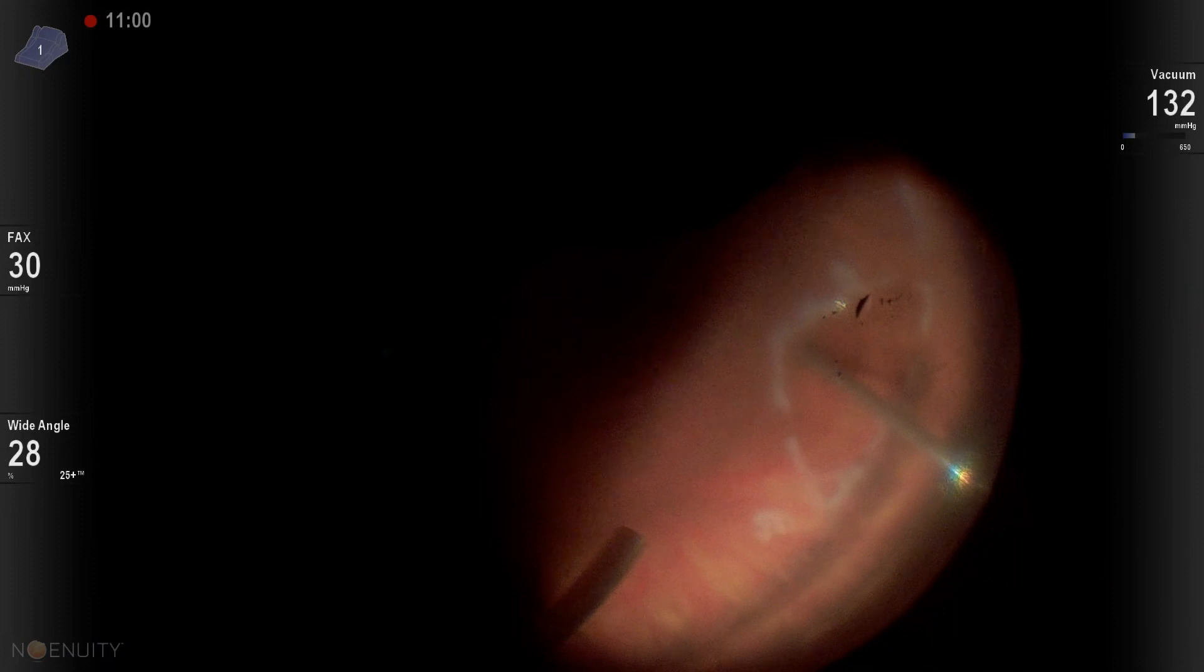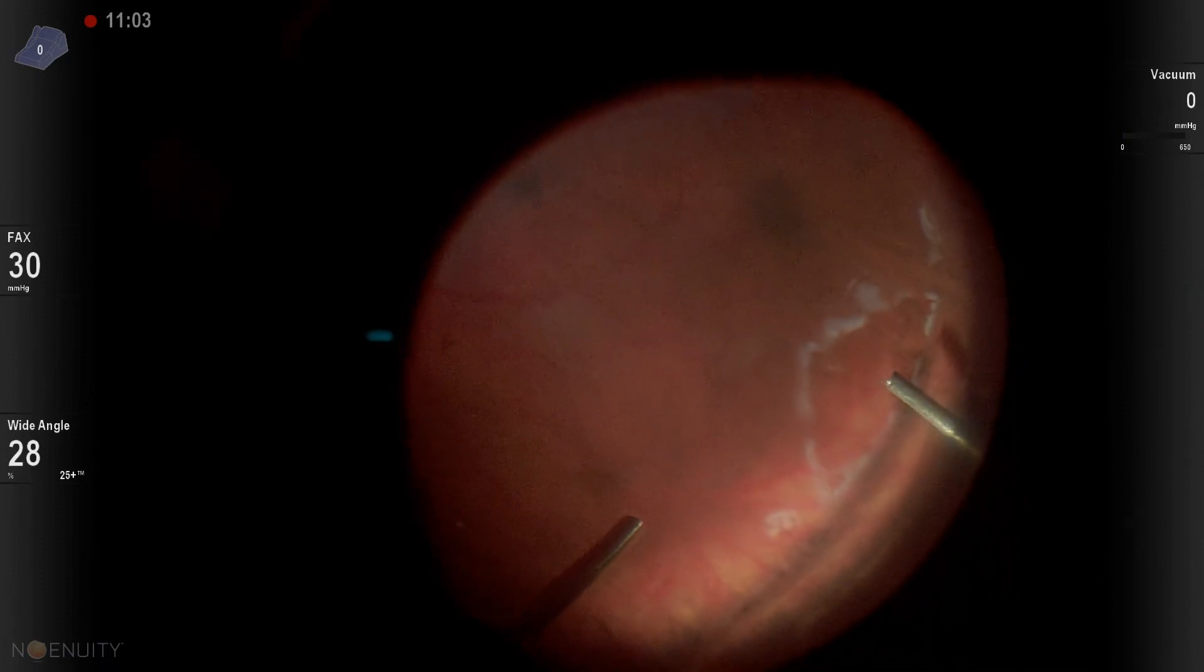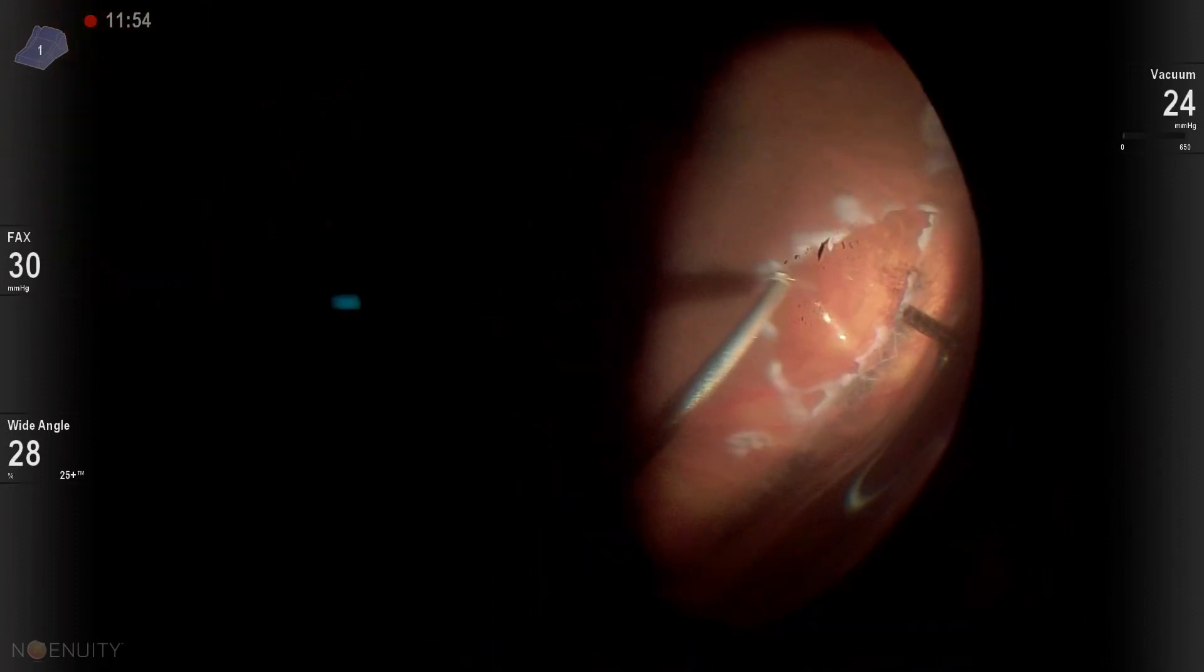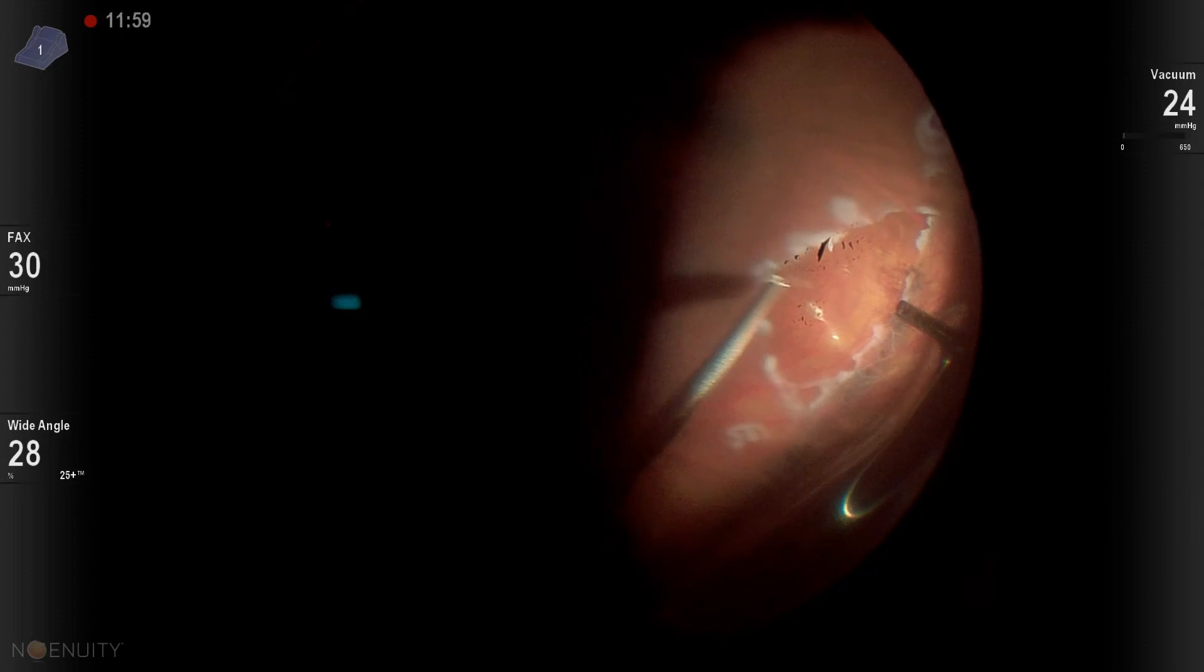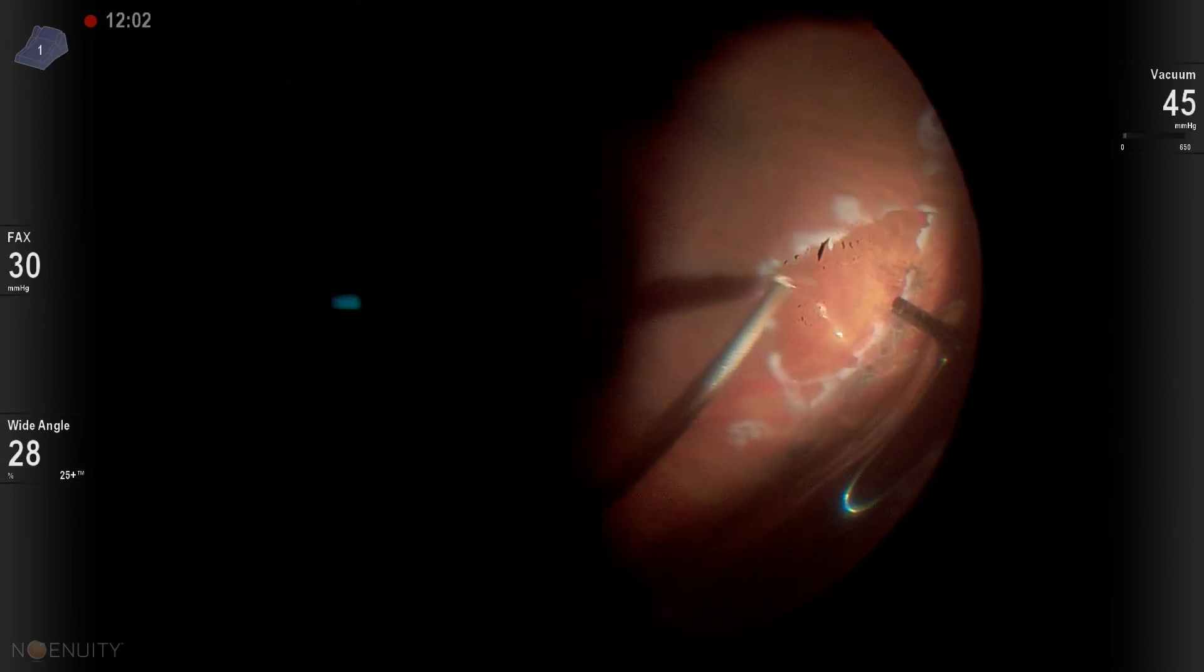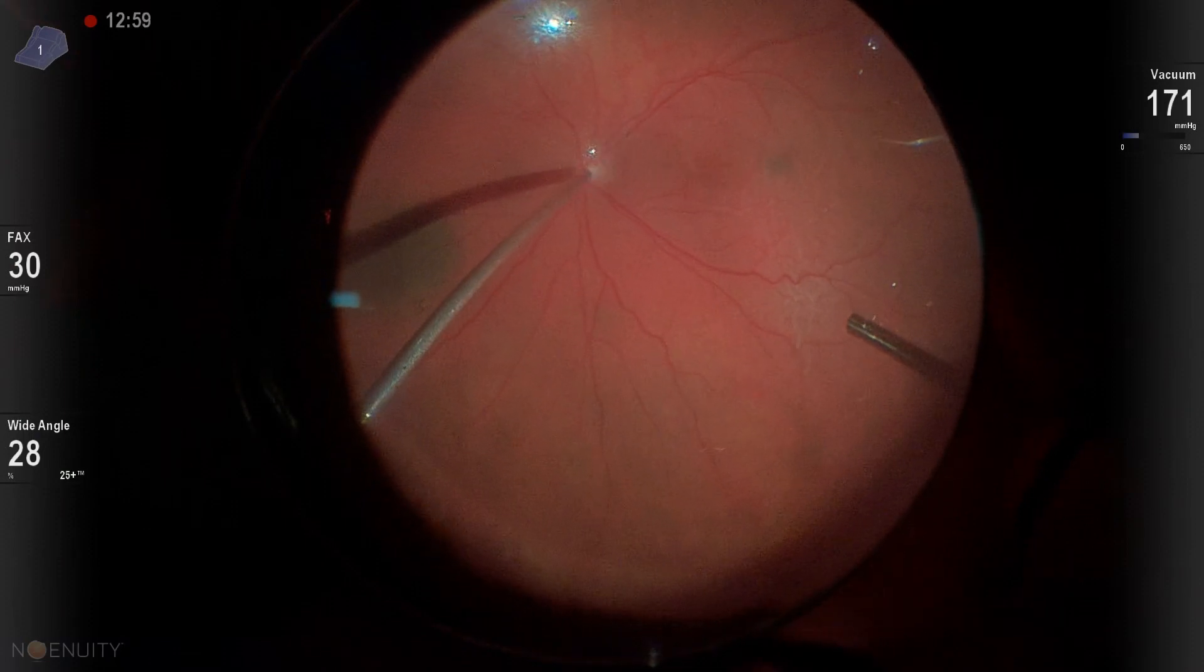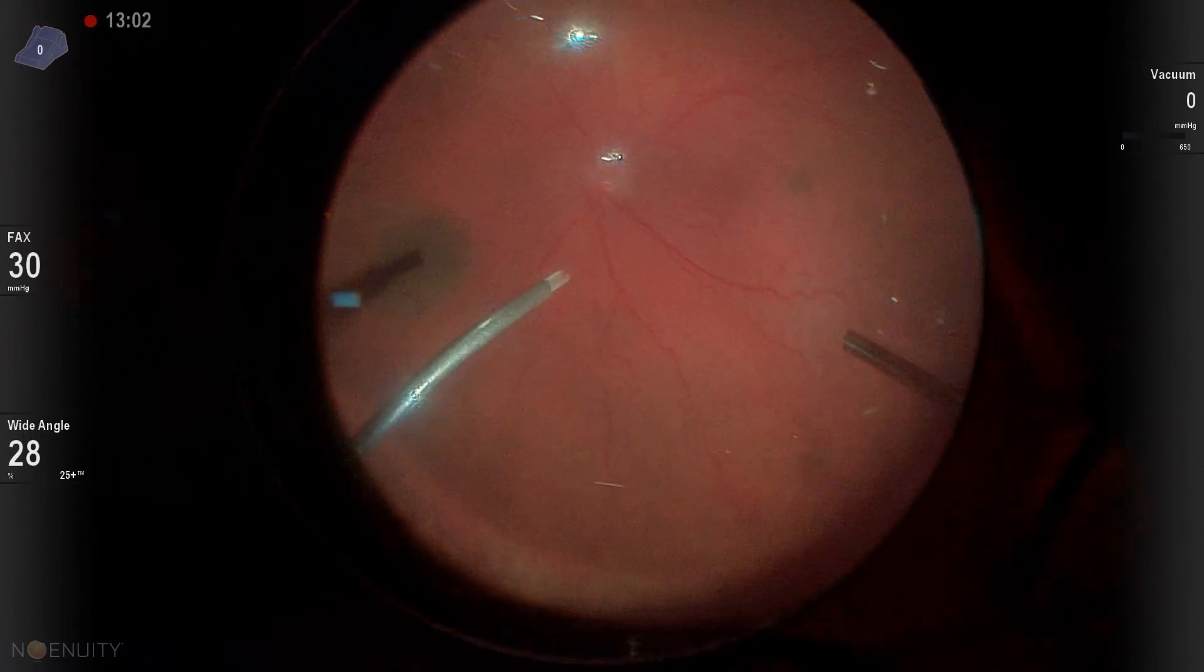Now we're going to go ahead and just aspirate a little bit more right at the edge. Sometimes I'll turn off the cutter to do this. And then we'll come in with the soft tip actually. And the soft tip is where we want to try to snake that little soft tip, that silicone soft tip, underneath the retina and just try to get that edge bone dry. Dry off over the optic nerve to make sure that we've removed all the fluid from the eye.